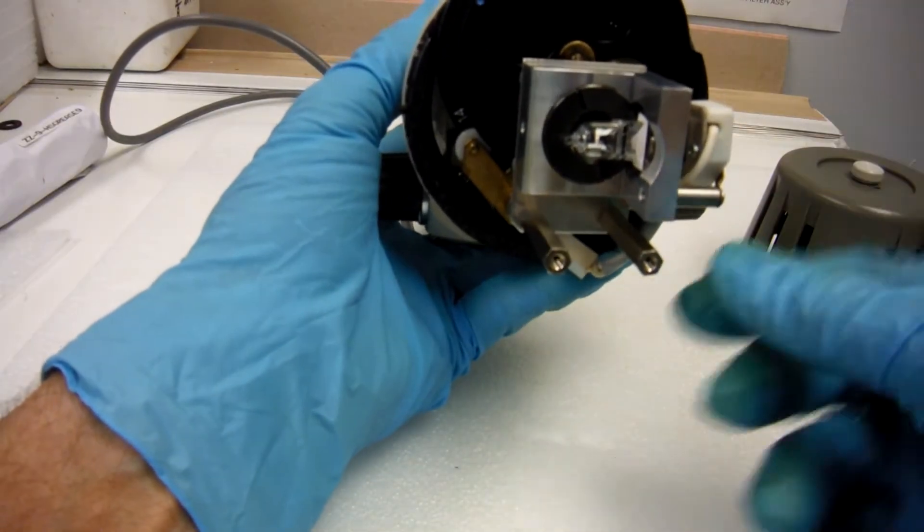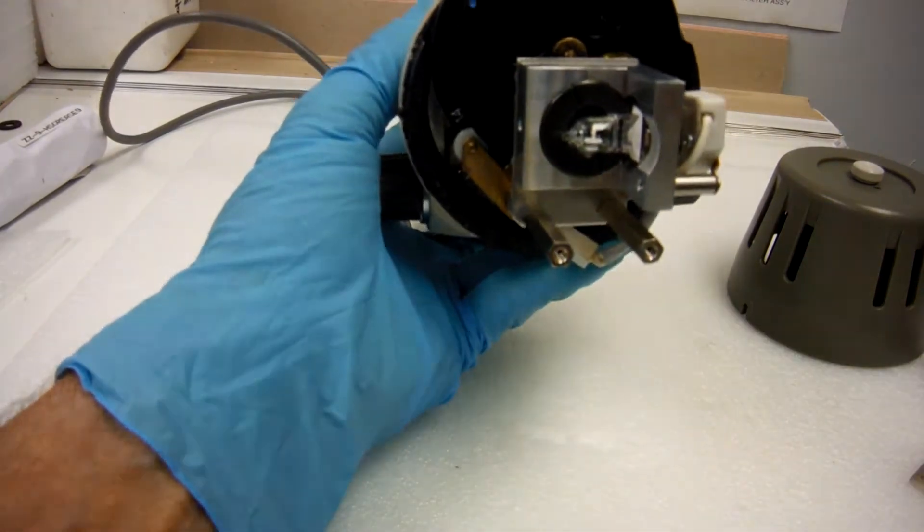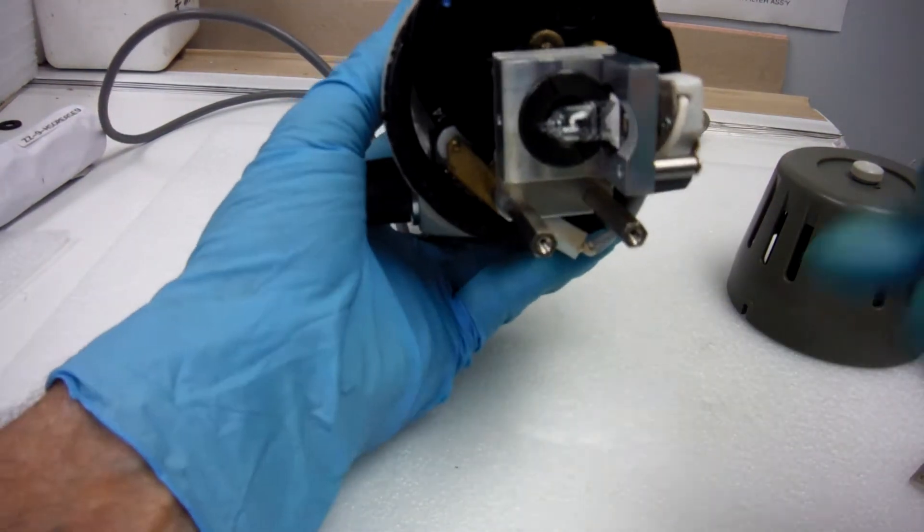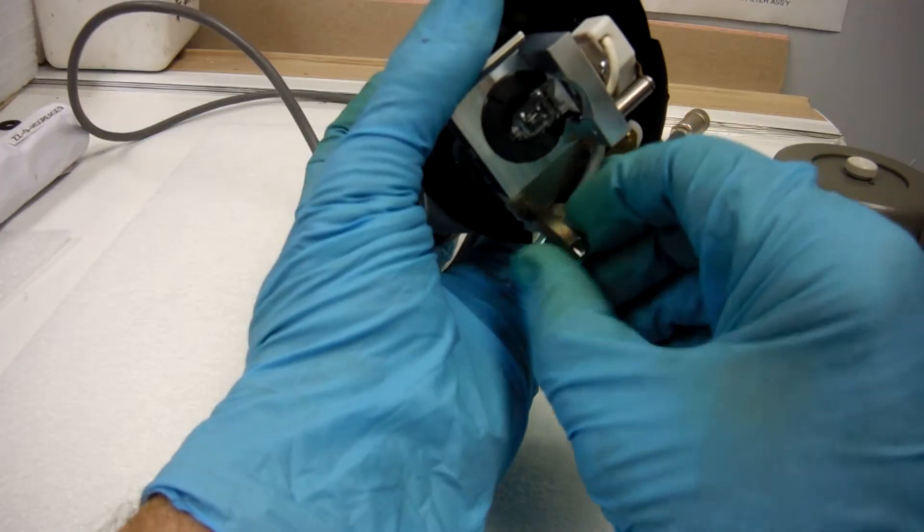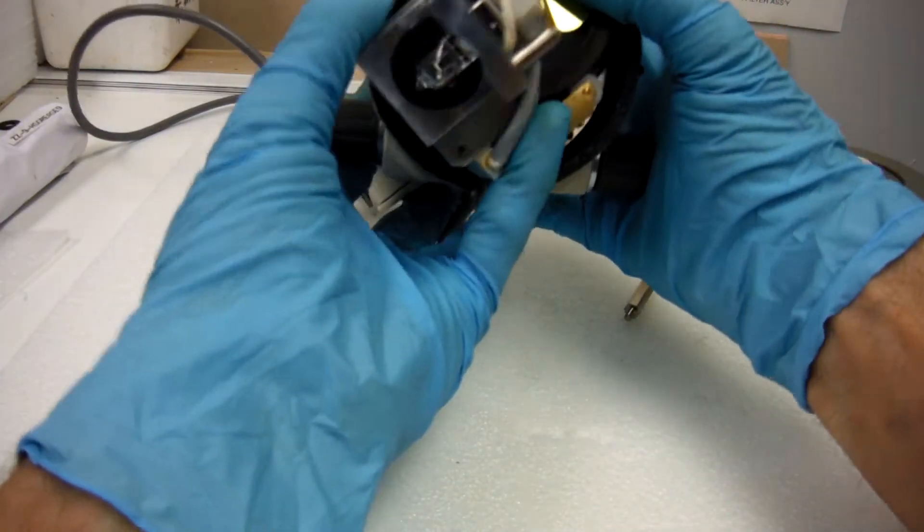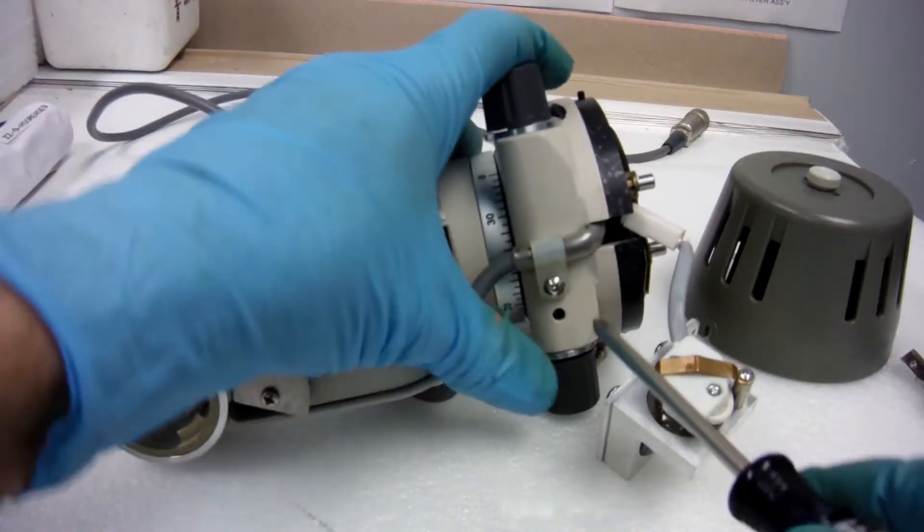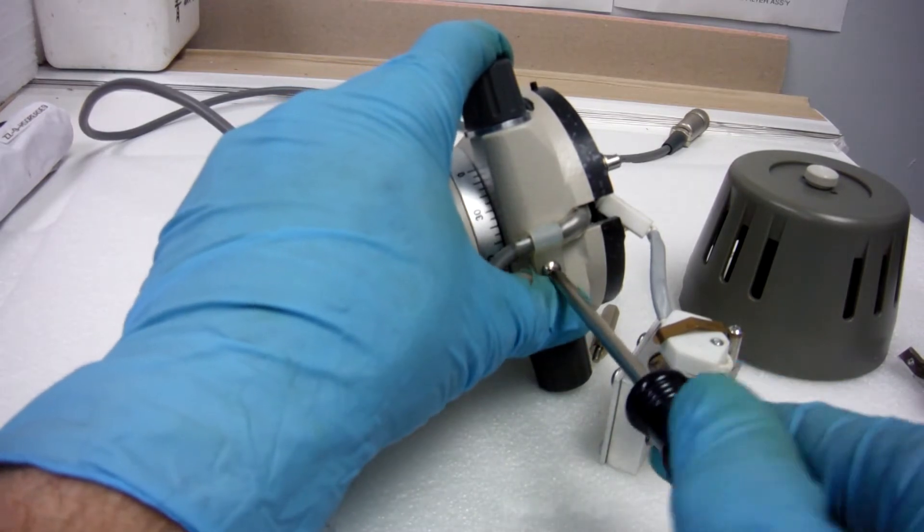You have two studs holding this lamp housing on. Get your crescent. Unscrew these. We'll remove this bottom screw holding the wire harness on.